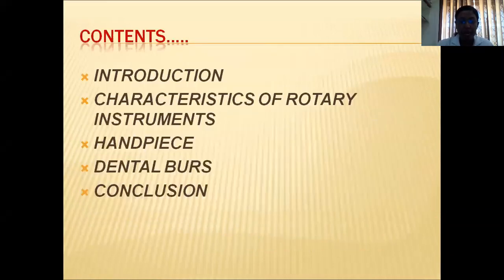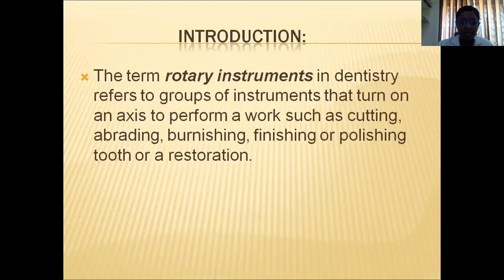The contents of my presentation are going to be: introduction, what are the characteristics of rotary instruments, what are the different types of handpieces that are used, and what are burs, and a final conclusion.